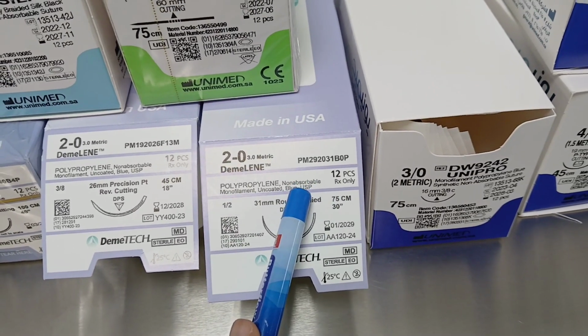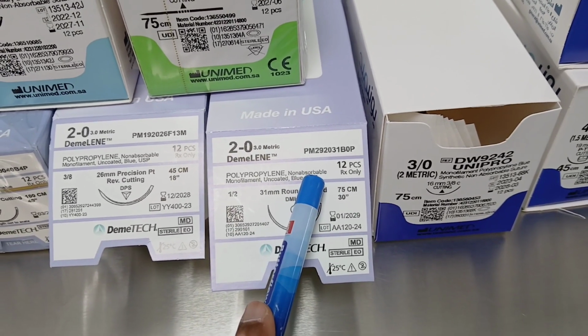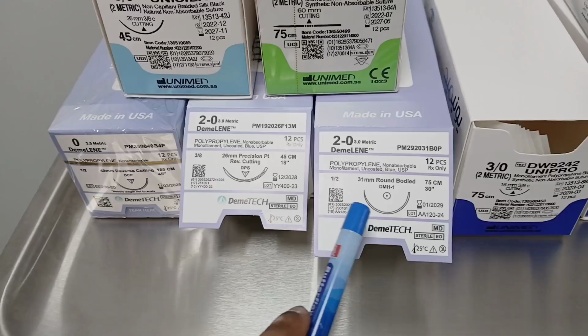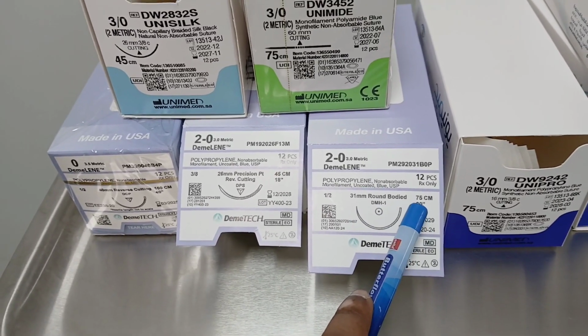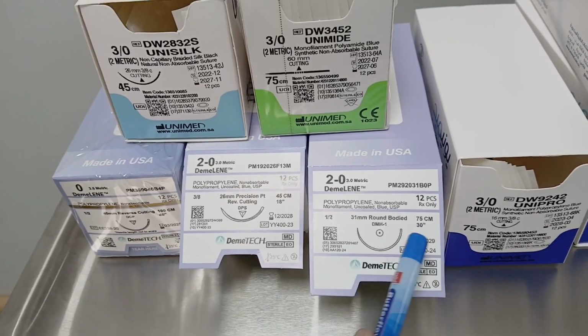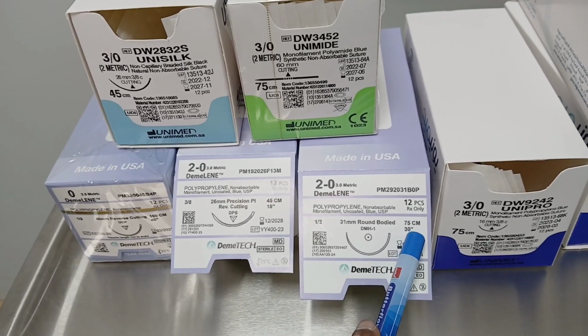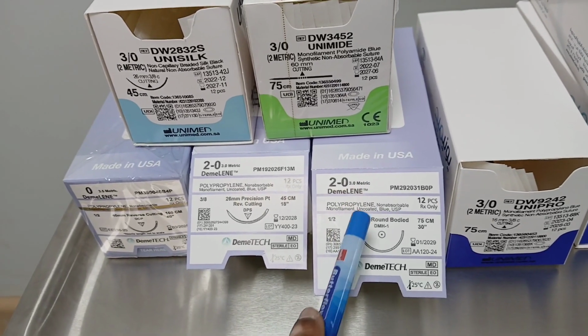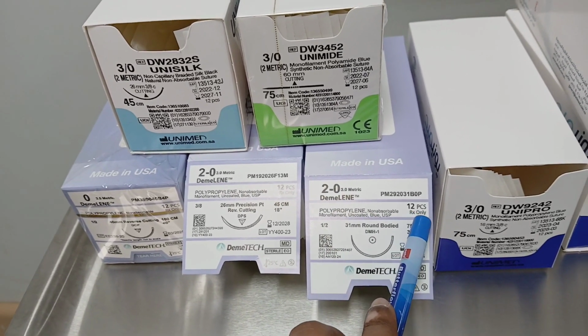Then we have to see absorbable or non-absorbable suture. Then we have to check the needle point. Then we have to see how much length of the suture material. Here the Prolene length is 75 centimeters. Then we have to check how many sutures are available in one box. Here 12 pieces.